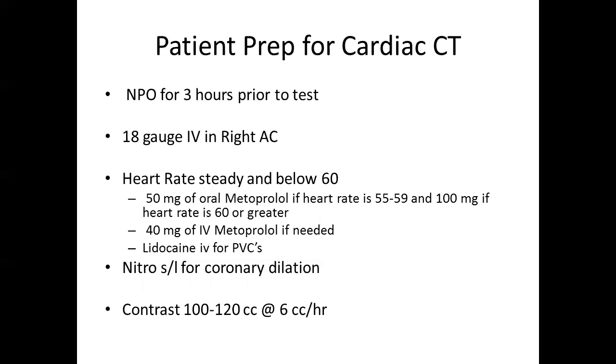Do you give the nitro, obviously, how much pre-contrast? Because contrast on its own can be a vasodilator. You give it a fair amount, like minutes before you give the IV. What's your nitro time? We beta block them as much as we can, and then we decide are we going to scan or not. And then once we've decided we're going to scan, pop in the nitro, come out and scan. So it's minutes.